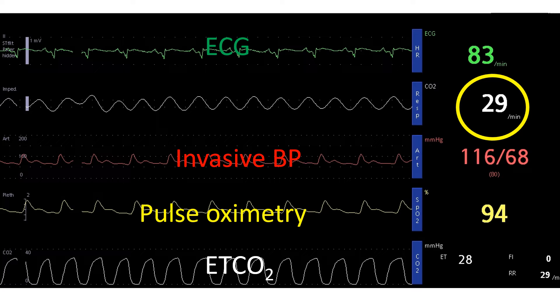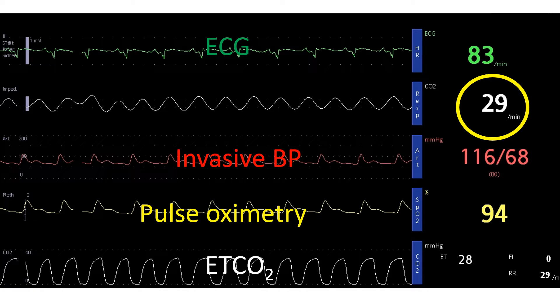Here the ETCO2 is shown as 28 mmHg. Respiratory rate drawn from the capnography is 29 per minute. The topmost tracing is electrocardiogram, which shows normal sinus rhythm at 83 per minute.